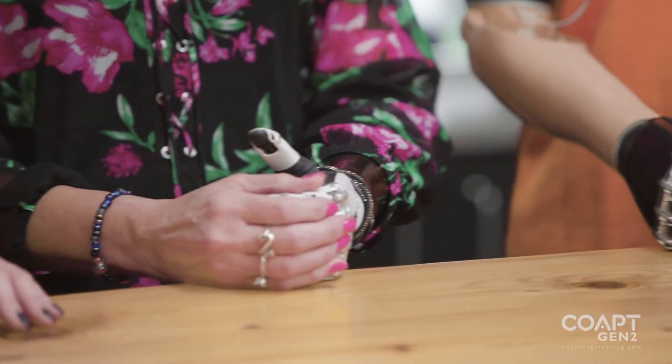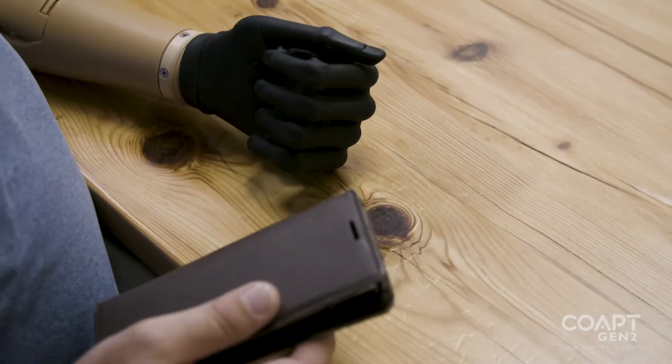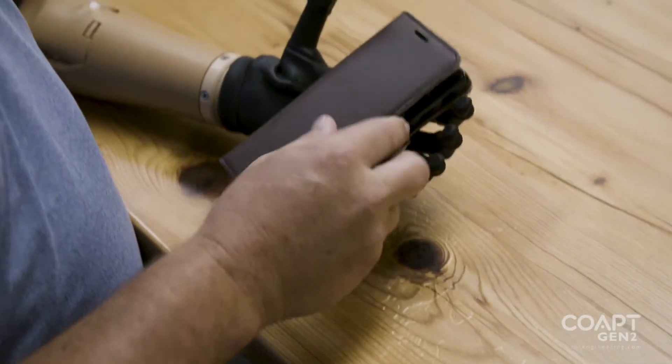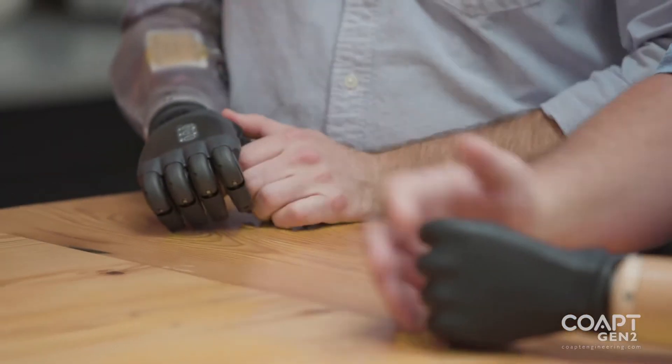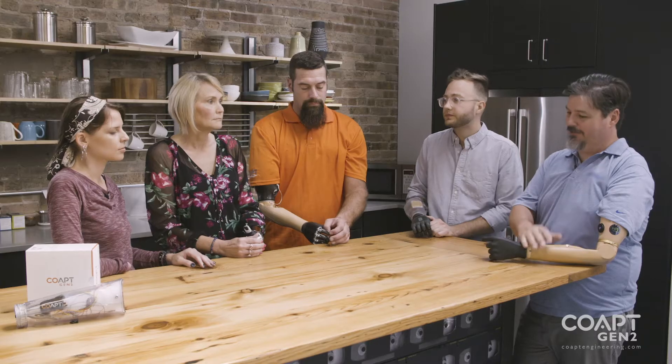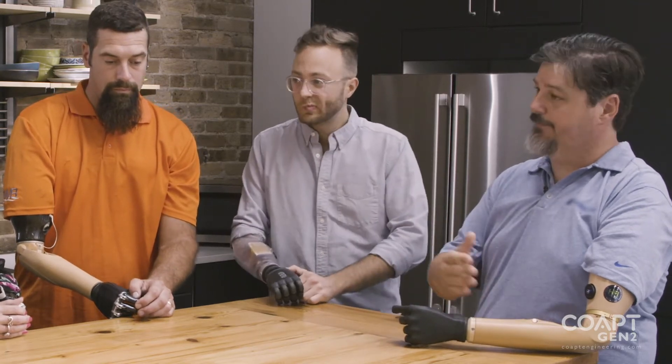The co-op system is picking up those muscle signals. The muscle signals are then translated into what you perceive as opening or closing your hand. Before, I felt like I had three different types of machinery I had to operate — I had an elbow, I had a wrist, and I had a hand to operate. Now it's become one unit that works together in unison without having to think about the transition between the different parts of your arm.